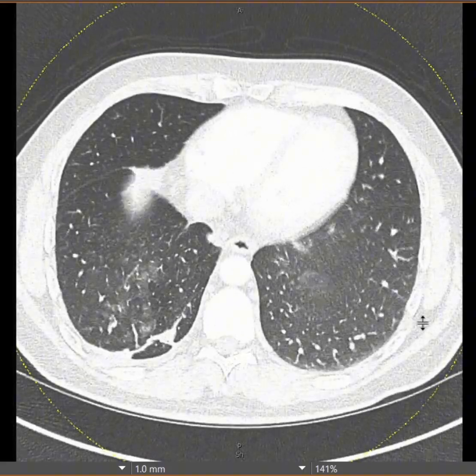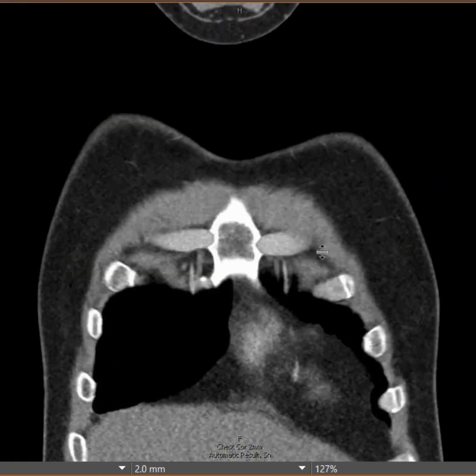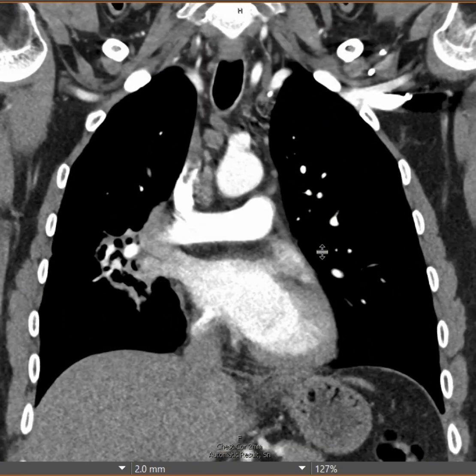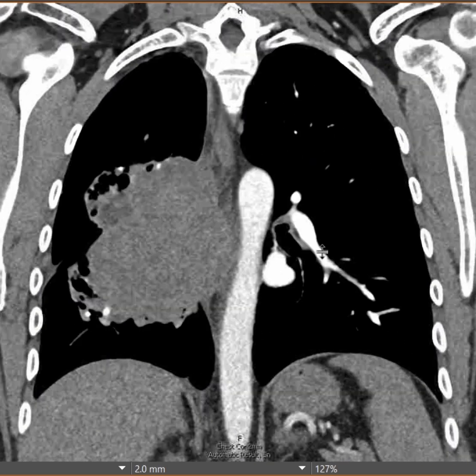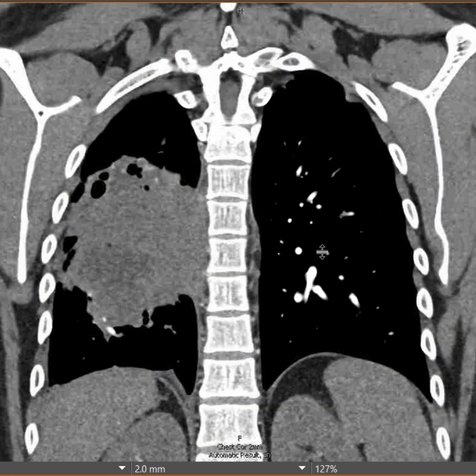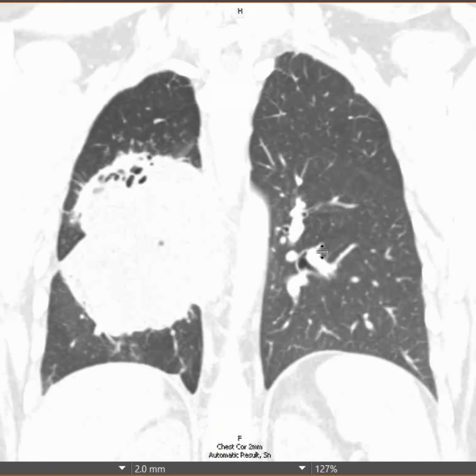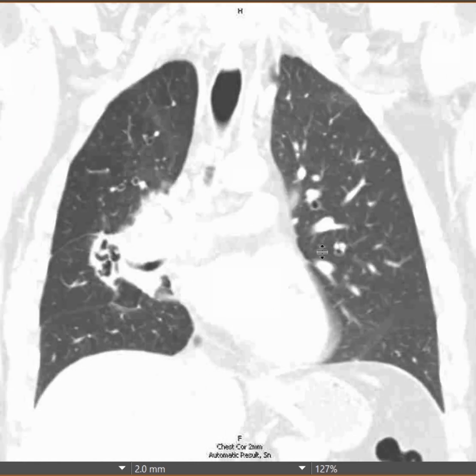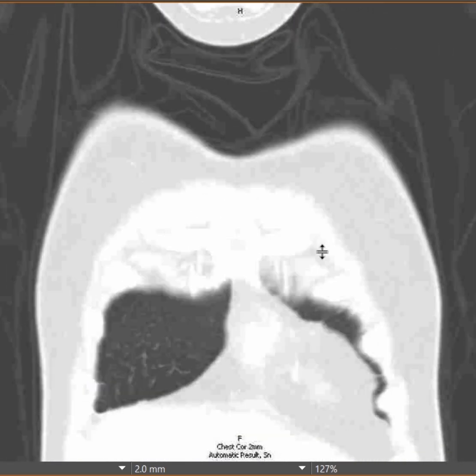And then he developed a terrible problem with infection and pus and some hemoptysis. And so we were forced to operate. Look at the coronal section. You see the abutment of the PA. And again, many of you would say, well, this has to be done open. It's 18 centimeters. It's a gigantic tumor. It's almost in the carina, etc. How can you possibly control the vessels? How can you control the vessels on something this big and do it robotically? Well, the answer is, let's watch the video together.